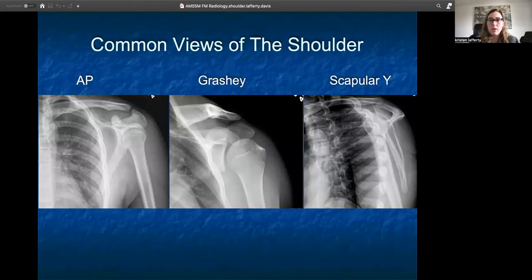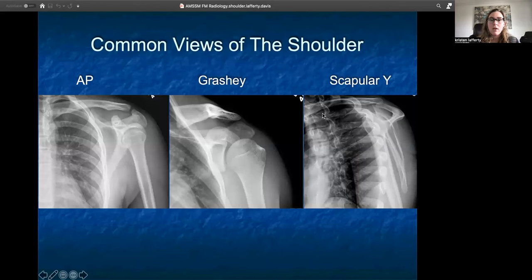These are the views of the shoulder we'll go over today. You have your AP or anterior-posterior radiograph, your Grashey, which is an internal oblique view, and then your scapular Y. We'll go over what each is useful for.